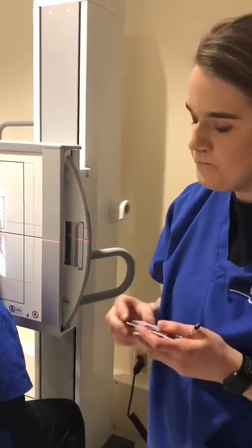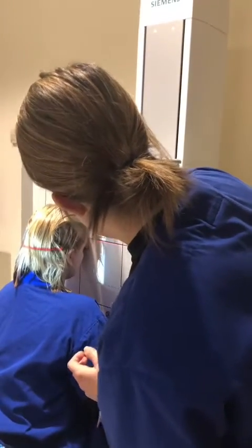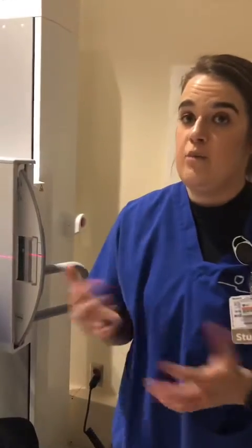And I would also have the patient take out her earrings too, just so that the metal won't show up. So next I'm going to mark the right side of the patient's body once again. So I'm going to stick my marker in the corner here, making sure that it's not in any of the anatomy of interest. And then I would go grab my calipers now that I am ready to make the exposure.